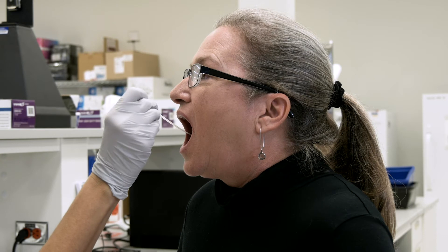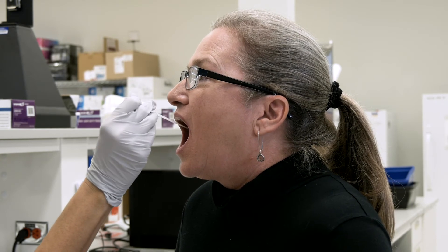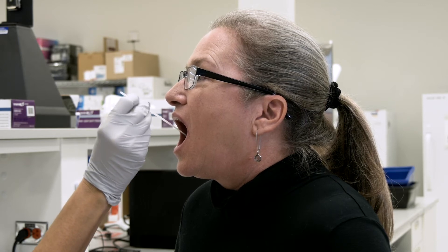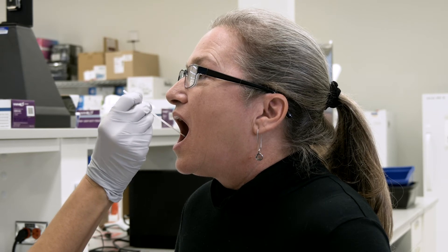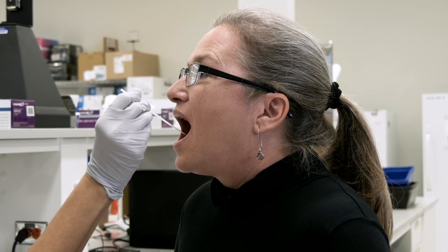Rub the DNA collection swab up and down against the cheek 30 times. There should be a little pressure applied to ensure cell collection, but not enough to cause discomfort. As you rub the swab up and down, occasionally rotate the swab to ensure every part of the tip surface collects some cells. Also rub inside the gum line. The goal is to collect as many cells on the swab as possible.